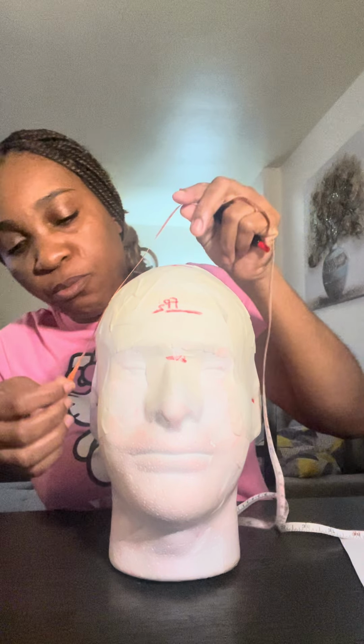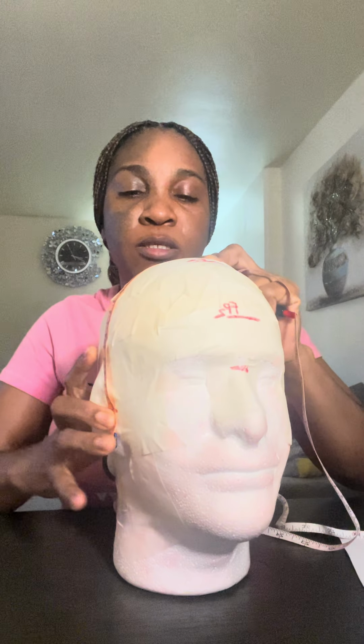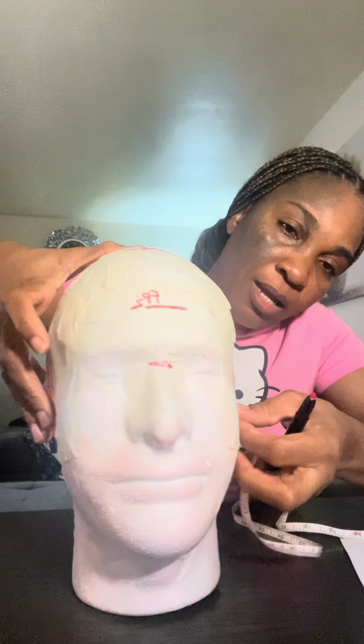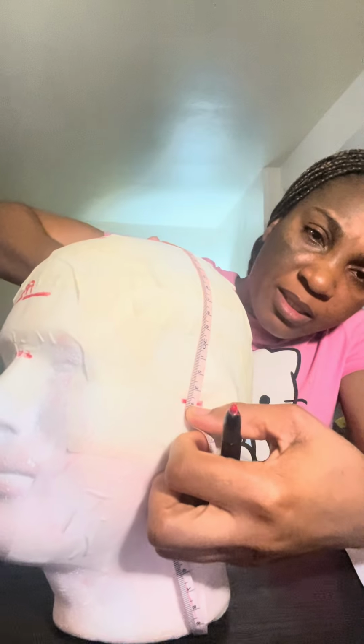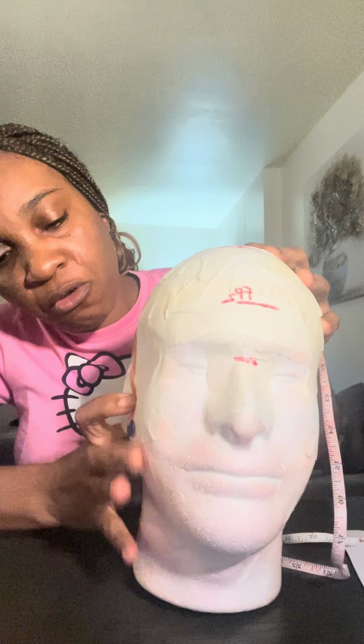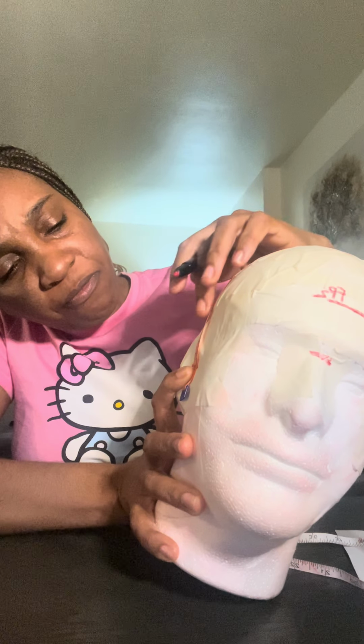Now I'm going to go to my coronal measurement. My coronal measurement is from the preauricular left to preauricular right. So I'm going to take the total measurement, putting my 0 mark on the preauricular left, going through my CZ, the middle, down to the preauricular right. So I have 34. Total is 34. So I'm going to do 10% of the 34 from preauricular left, putting my 0 mark, which is 3.4.